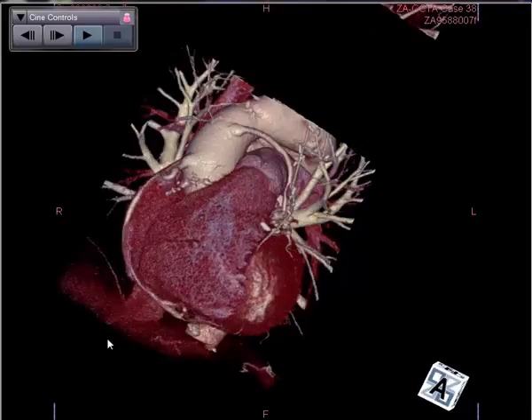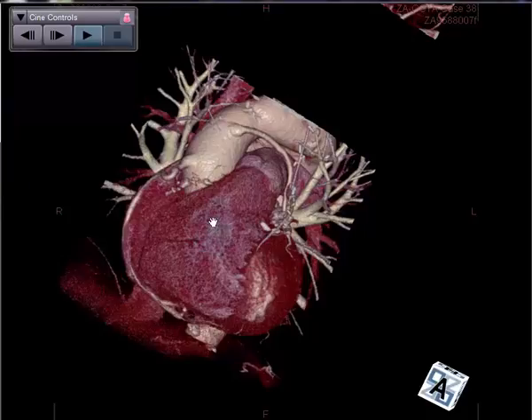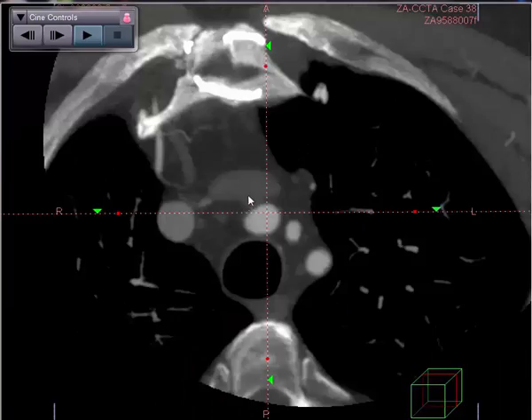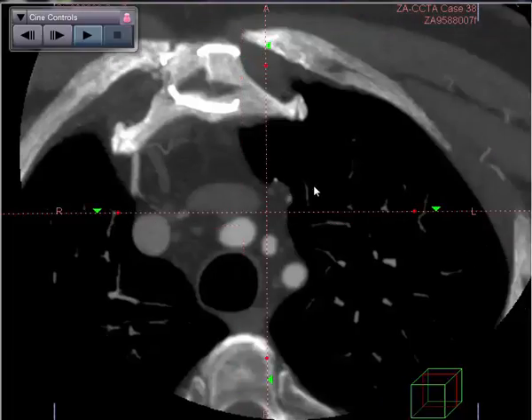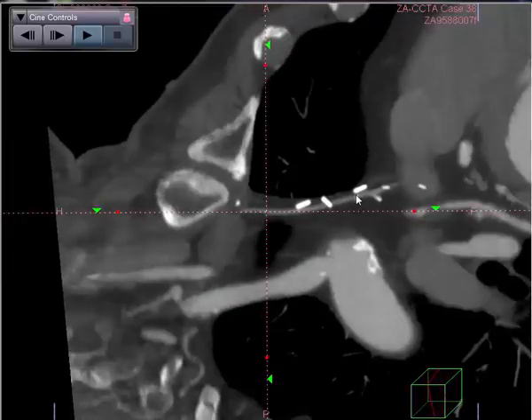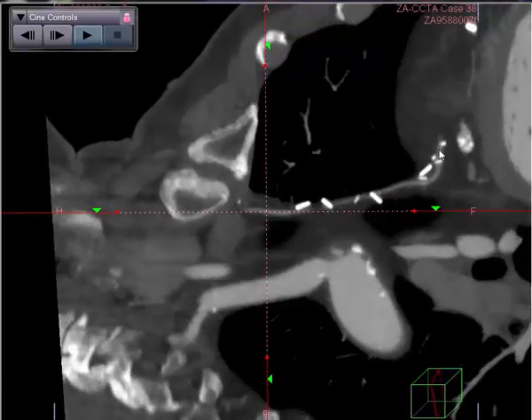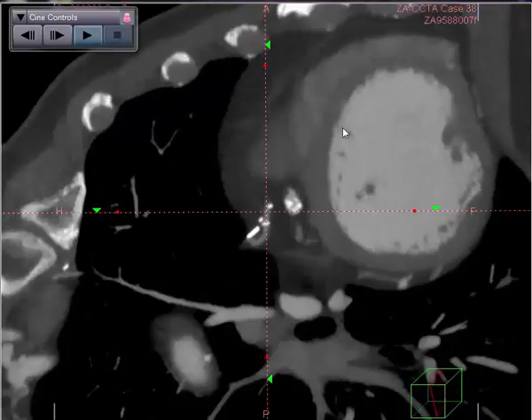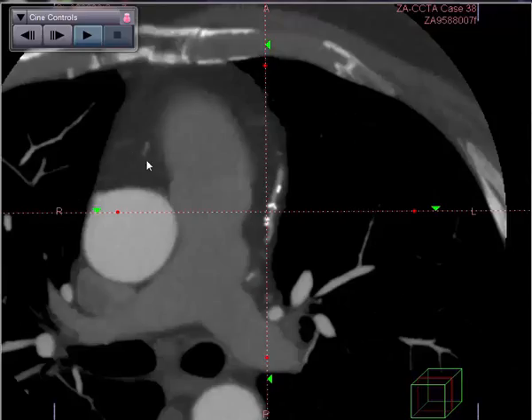Let's now switch to the two-dimensional images to get a better idea of what's going on. I'm going to bring this over and put it in a foot view. Let's start by looking at the internal mammary graft. Since I know that it goes anteriorly, I can follow the graft all the way down as it feeds into the LAD. So this is a widely patent internal mammary graft with excellent distal flow.